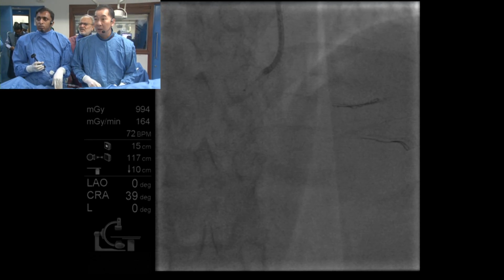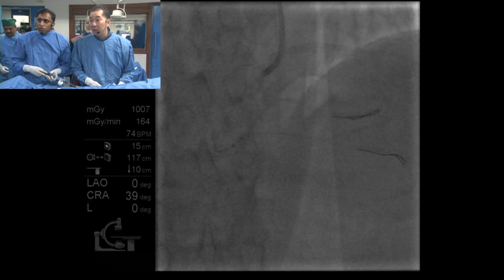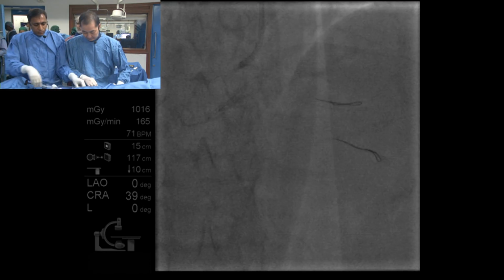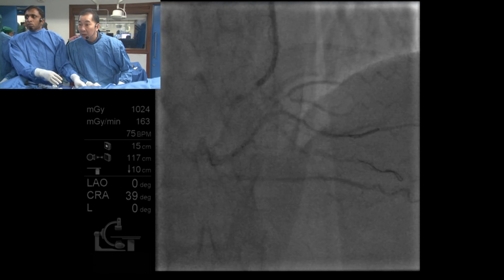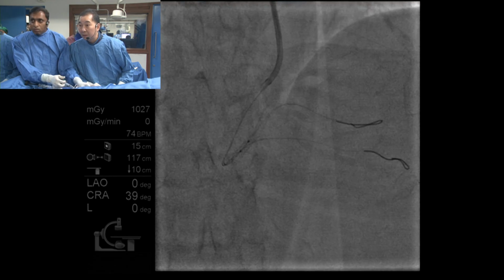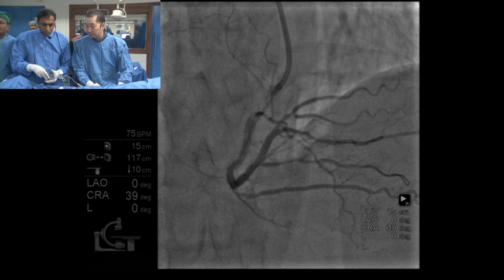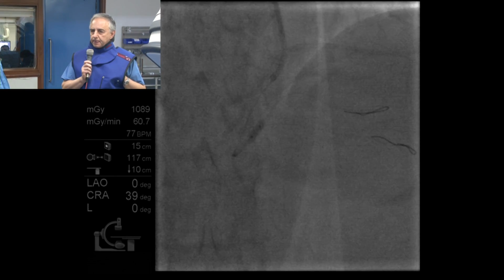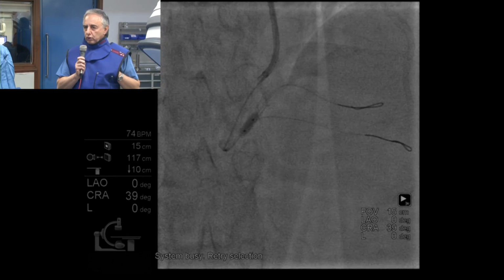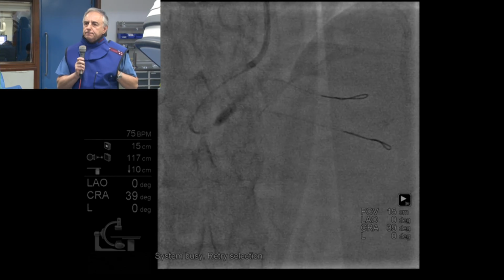It seems to me like you're really reversing the effect of the side branch balloon by doing this post-dilation, that you're putting the struts back down where they were before. It may be fine, but it's not clear to me what the advantage of the side branch balloon was. Okay, let's go. Normally, personally, I do take the wire out and I do the proximal optimization without the wire. Why? I think it's the best way for the struts to move towards where you want them to go, and not to have the wire blocking that. Can you do an aerial?